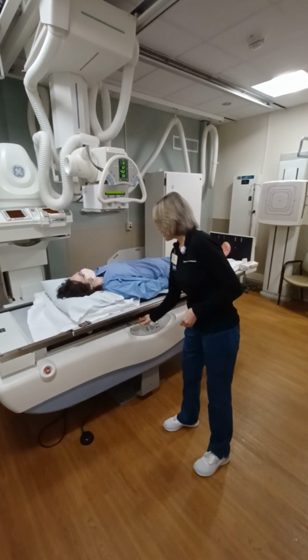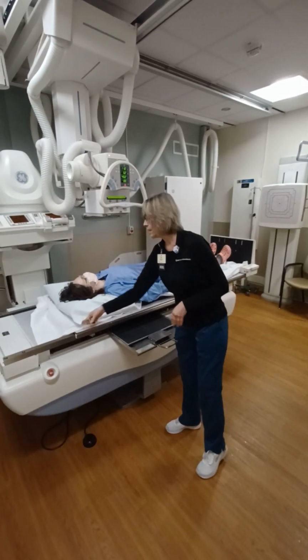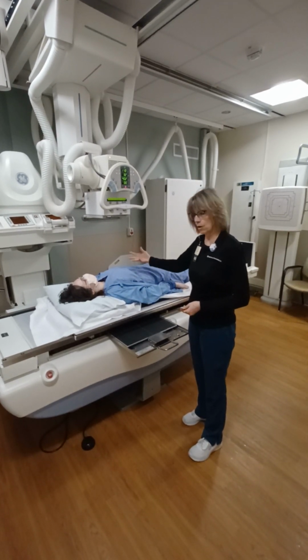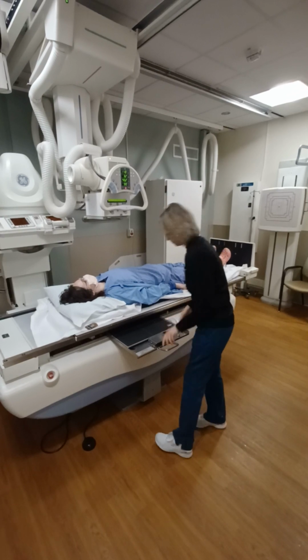first. The AP and the PA projection of the stomach should be done on 14 by 17 size cassettes. It does allow the radiologist to see a little bit more of the abdomen, also including a little bit of the small bowel once the barium has gotten into it. Take my right marker, place it down in the corner here.